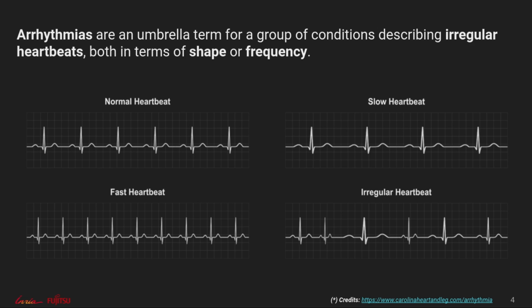But it can also come from the frequency of these heartbeats, linking to more popular conditions such as bradycardia or tachycardia. And because the latter is easier to monitor through peak detection algorithms, for instance, we ended up very interested in the way to represent at best the information about the shape of these heartbeats. This is exactly what led us to the introduction of topological data analysis to help us in our classification tasks.